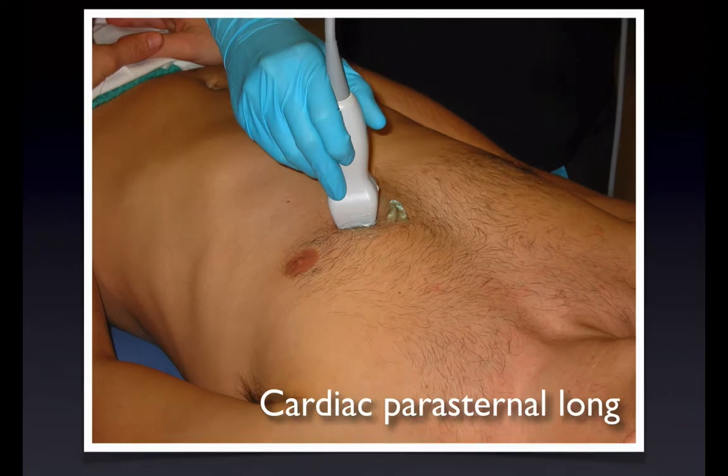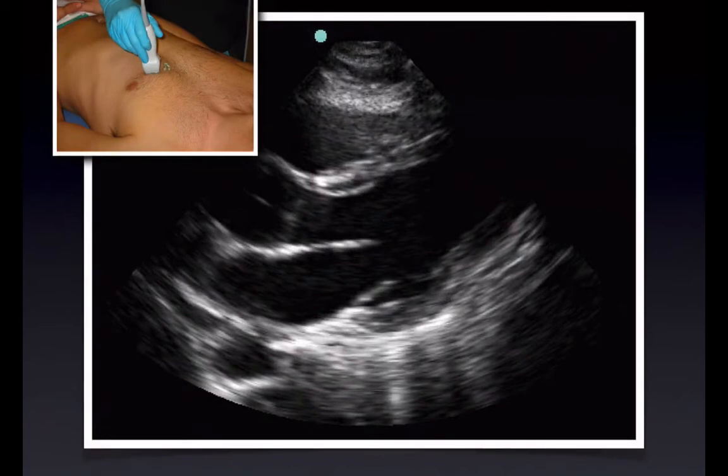So let's move on to the cardiac parasternal long axis that we could also do in the setting of trauma. If your patient has a distended abdomen or has a lot of air artifact, you just want to look at the heart. So you can go through the cardiac parasternal view at the level of the fourth or fifth intercostal space, and you should be able to see the heart.